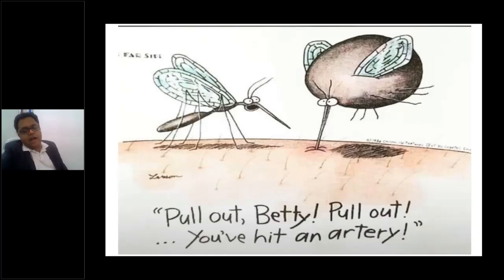However, an important thing that we need to keep in mind is that not all failures that we see in surgery or during surgery are because of a fault in the surgical instruments. There are faults which happen on the side of the surgeon, and they do not need to be reported as a fault of the instrument or the implant.